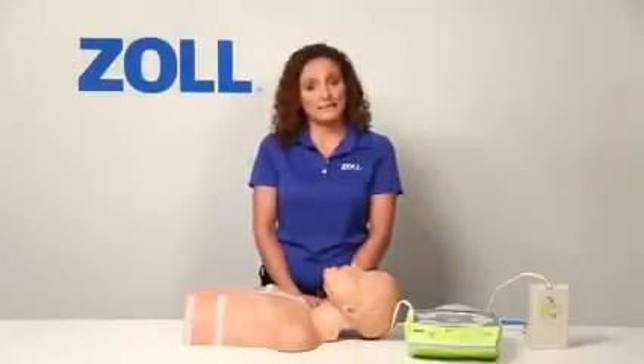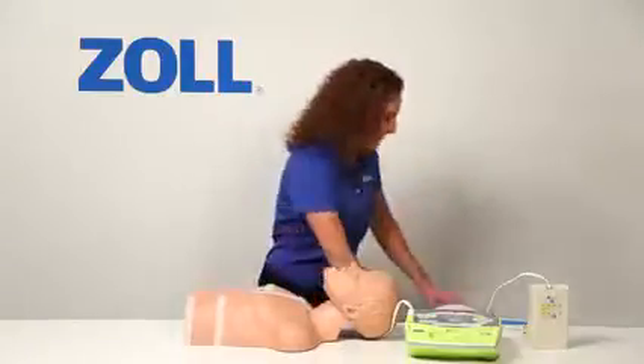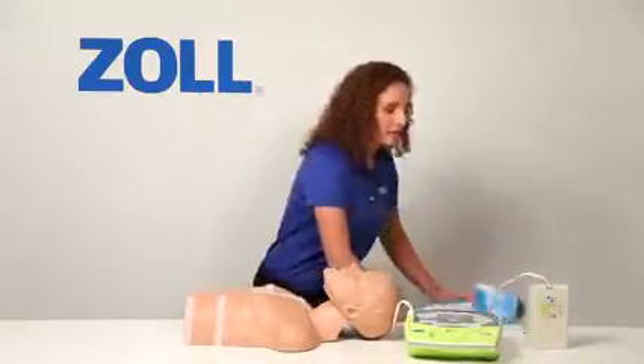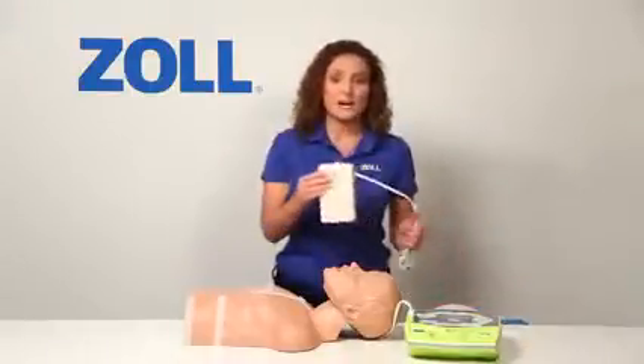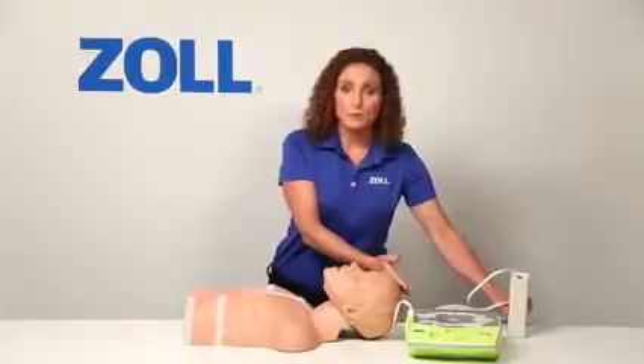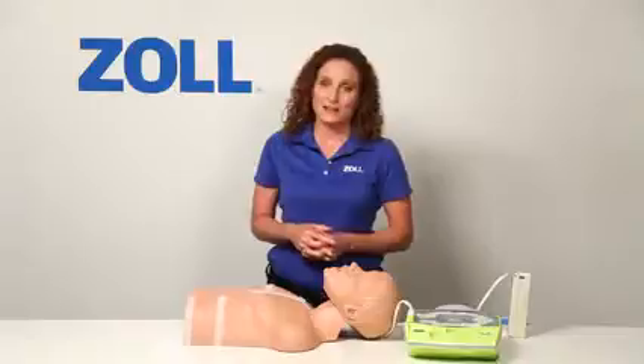Now I will act out a rescue and let you see what the AED Plus does during CPR. I'm going to attach these demo pads to this mannequin and then plug in this simulator to present a heart rhythm to the AED Plus. Notice how the AED Plus walks me through the rescue and how it supports my CPR with real CPR help.